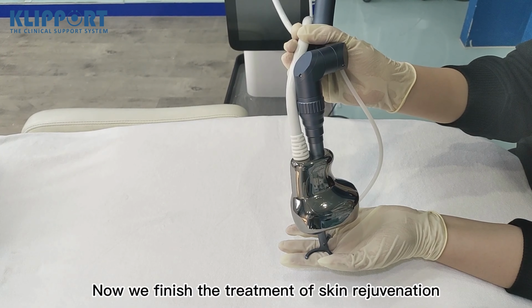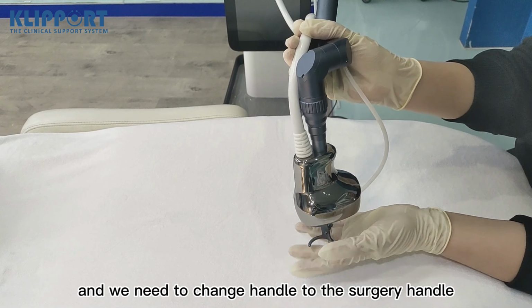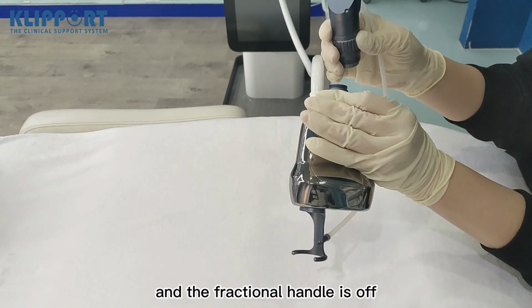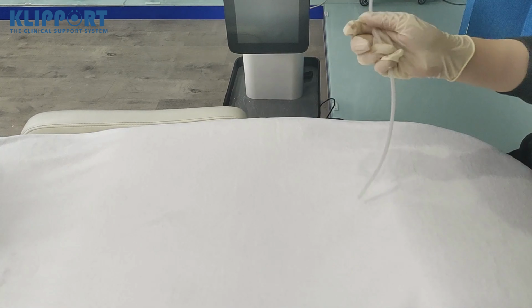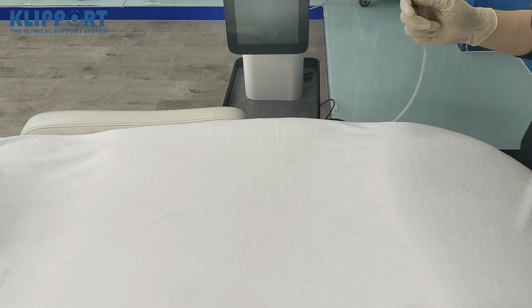We finish the treatment of skin rejuvenation, and we need to change the handle to the surgery handle. First, hold this part and rotate it. And the fractional handle is off, and we need to peel off this transparent cap. Then put the fractional handle away.